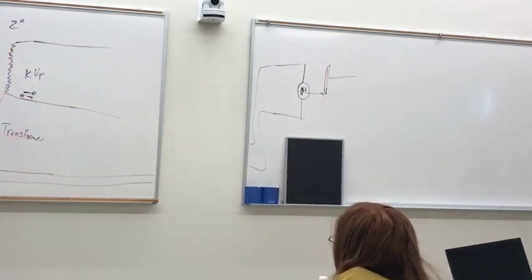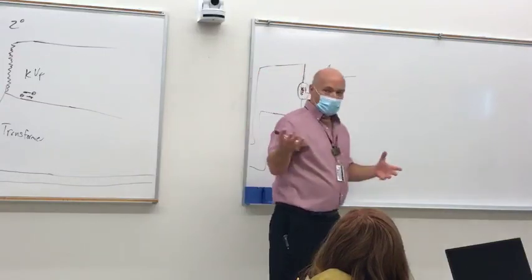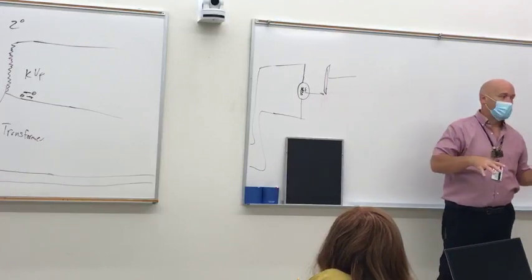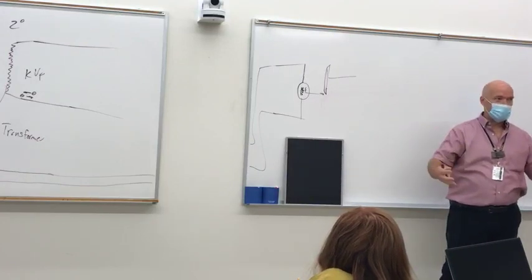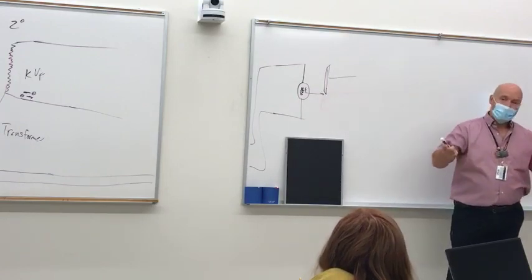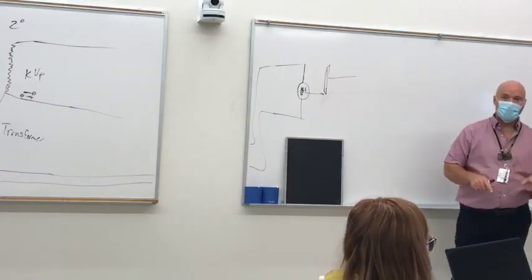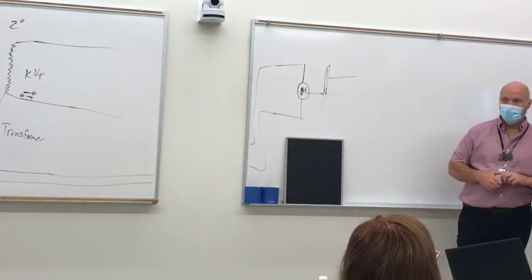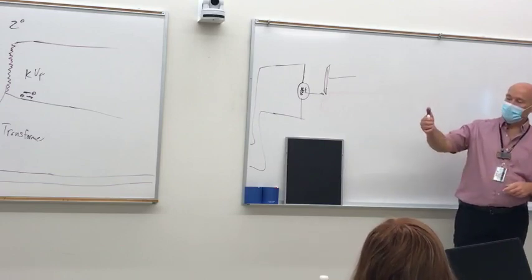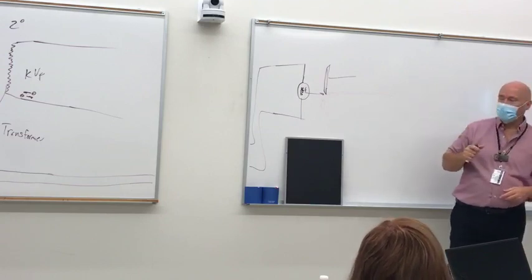Now, we come up to the point of creating X-rays. So you got a chest X-ray. Who was here Monday? Okay. Has everybody had an opportunity to look at the videos and get some sort of idea of what's going on? When you go back to make the X-ray, you've got a button, sometimes two buttons, that you push. One is a prep button and the other is an exposure button. If it's a single button, it's going to be a two-position button so that you push it part way down to prep the machine, and then when you make the exposure, you push it all the way down.